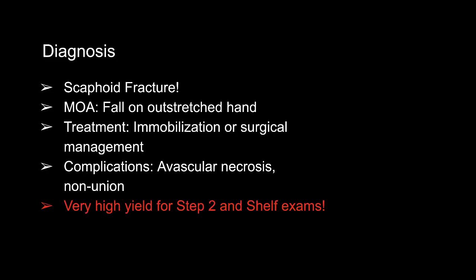Some are harder to see. The one we chose was a very clear one, but if you come across this image with a similar clinical scenario, it's a very good probability and safe choice to pick scaphoid.